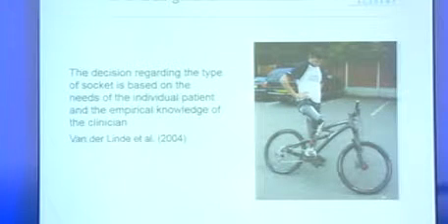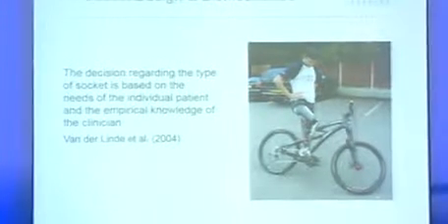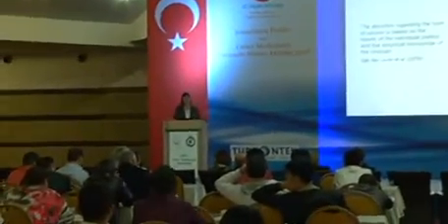When we look at the transfemoral socket, the decision really depends on the needs of the patient as well as the knowledge of the clinician.